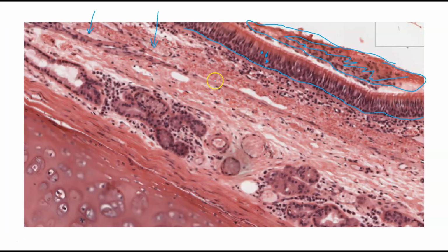How do we find glands? Well, we remember how to find glands. Glands are made of a simple cuboidal epithelium. So we got to look for cube-like cells, and bada bing, bada boom, we've got us a bunch of cube-like cells right here. So this submucosal gland here would be creating liquid that would run through a duct that would curl its way all the way out.